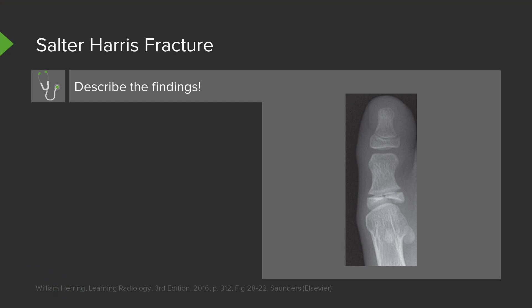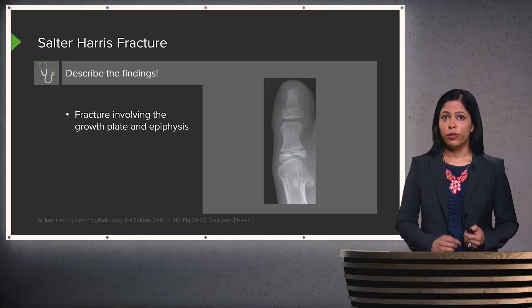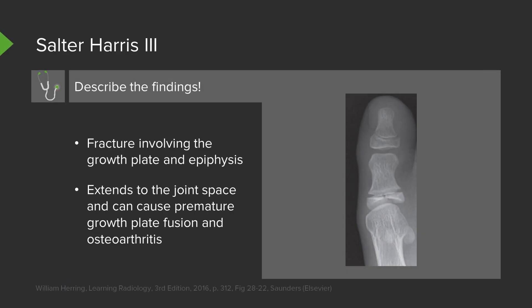This is another x-ray of the first digit in a skeletally immature patient. You can see the open growth plate here, and the arrow points to the fracture, which involves the epiphysis. This is an example of a fracture involving both the growth plate and the epiphysis — a type III Salter-Harris fracture. This does extend to the joint space because it involves the epiphysis, which extends to the joint space. This can cause premature growth plate fusion and osteoarthritis, and would need close intervention.